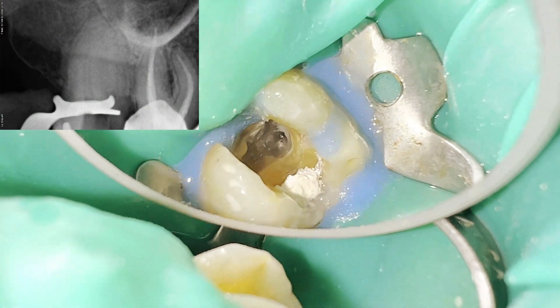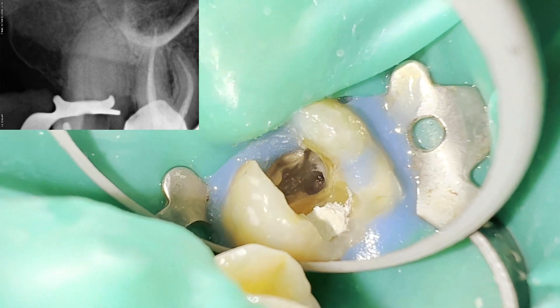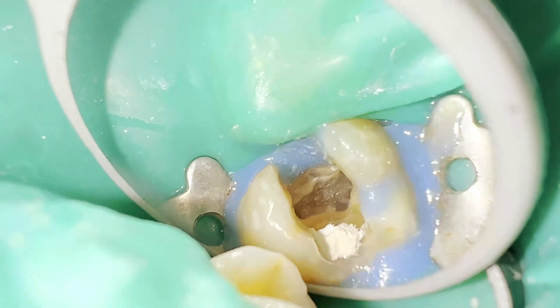Once we manage to extract the separated file from the root canal, we perform the endodontics in the usual way.